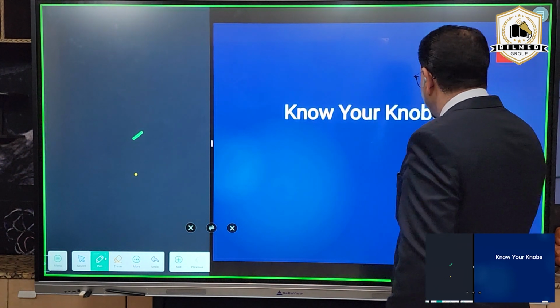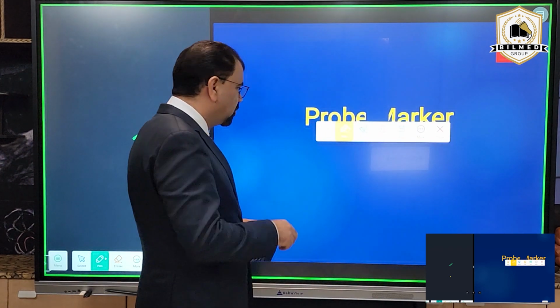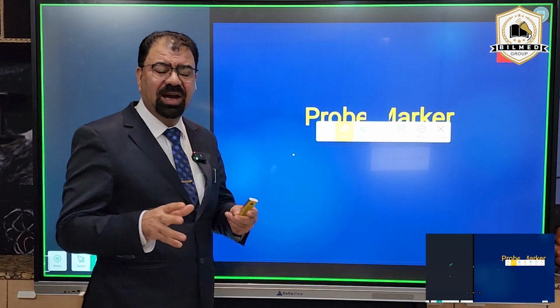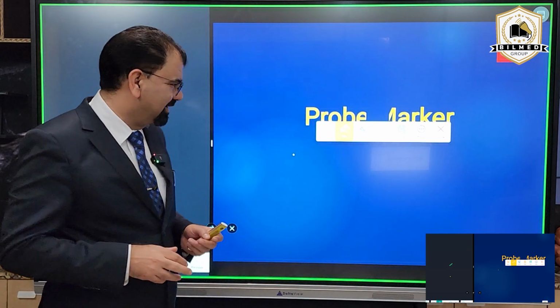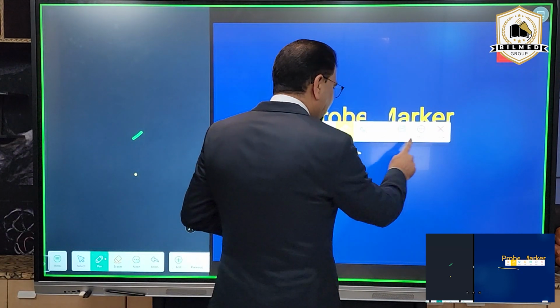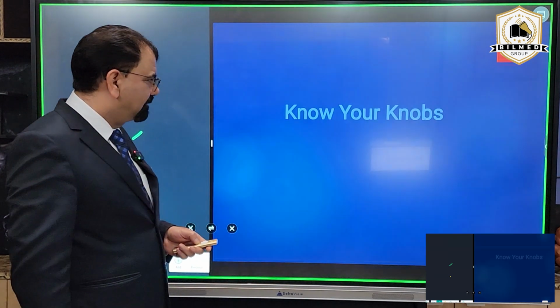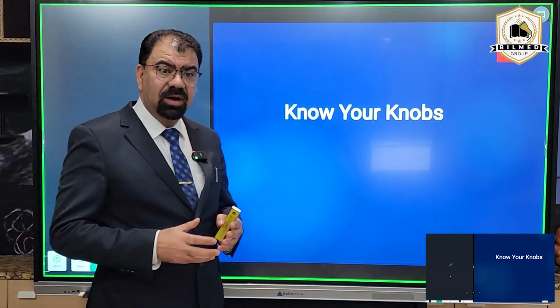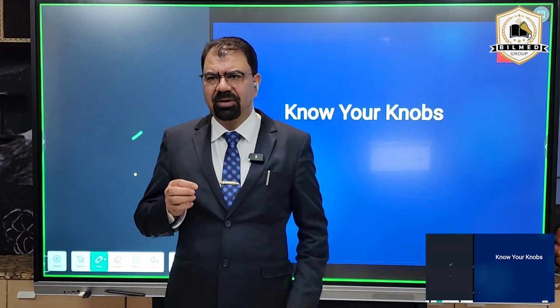No, I'm not talking about the probes. I am talking about why you are not able to use all the knobs in your machine. Why? I don't have basic knowledge about knobs also. Okay. We have to. Yeah, that is the point.